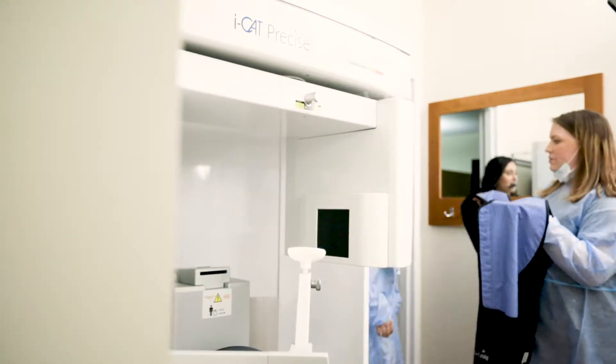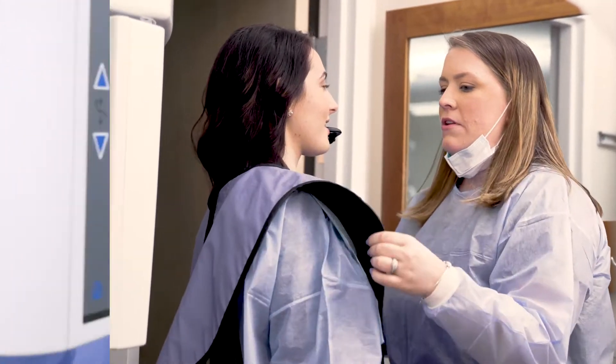After we attach the splint, my assistants will take a CT scan to register the patient.